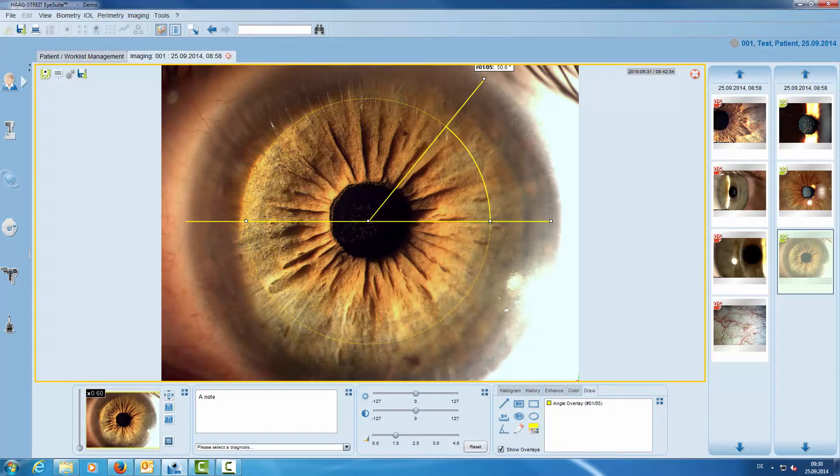Once we are finished with editing the image we save it and now we can quit the imaging viewer.